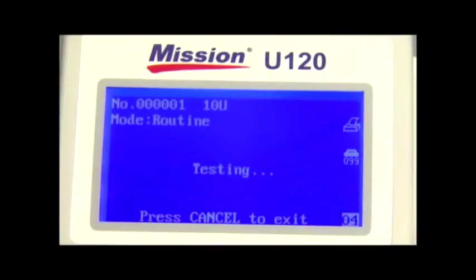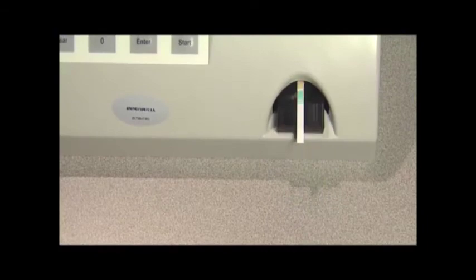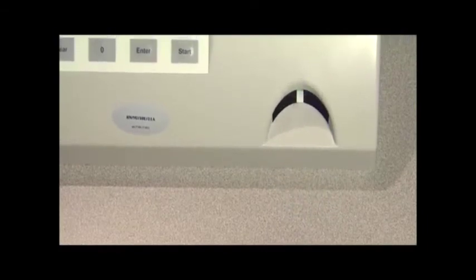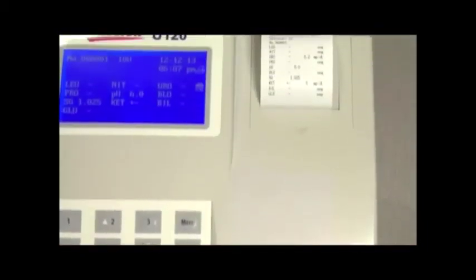When the countdown clock on the display reaches one, the strip holder will carry the strip inside the analyzer and begin testing. The results will be displayed on the screen and stored in the memory. After each test, any abnormal results will be highlighted on the screen and flagged on the printout.